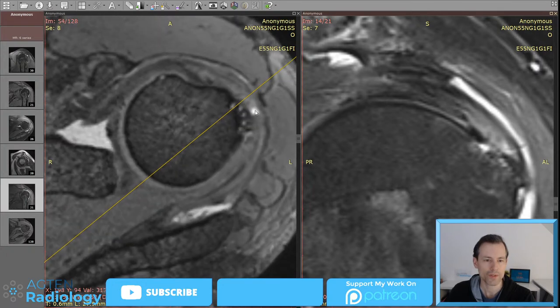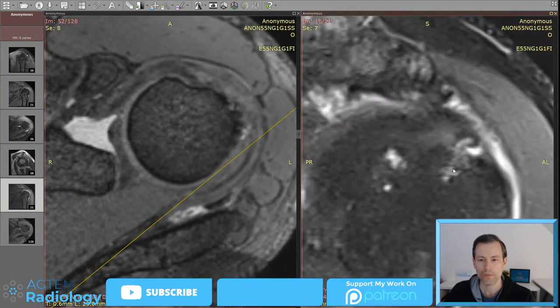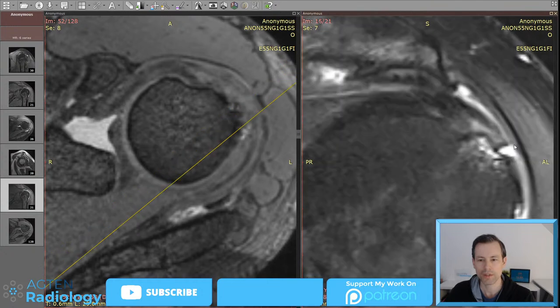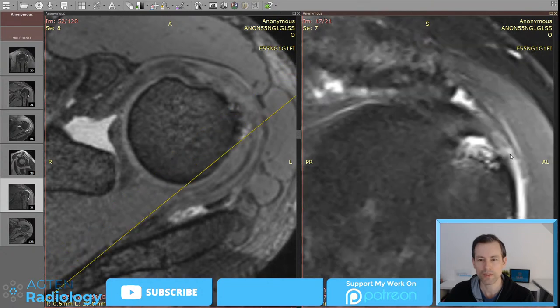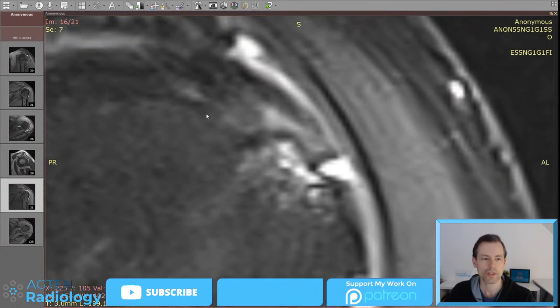And this is the other tear on the bursal side here. Okay. So if we are now going even from this portion here, more posteriorly, we have this kind of bursal-sided tear here, then we have another tear here. And again, I think that was the student's initial question.